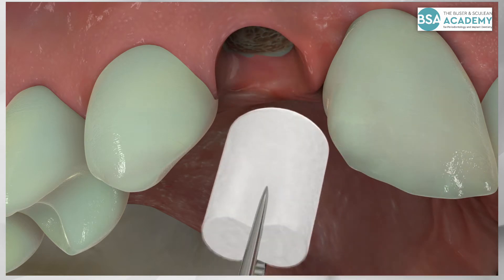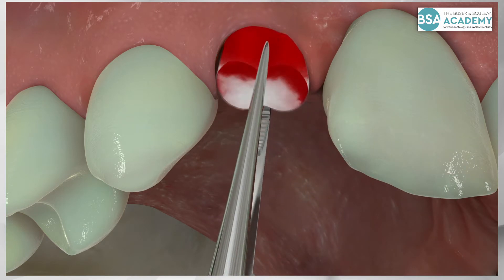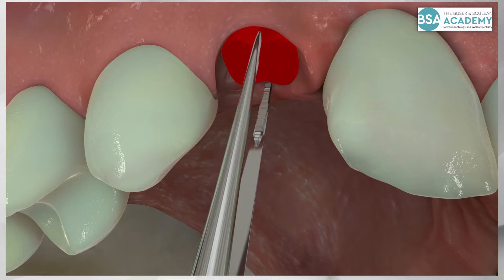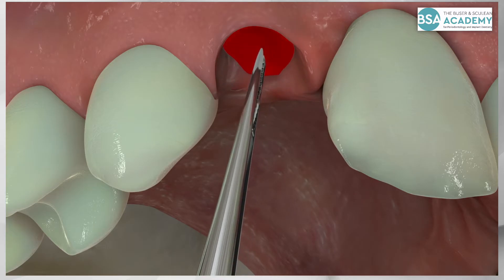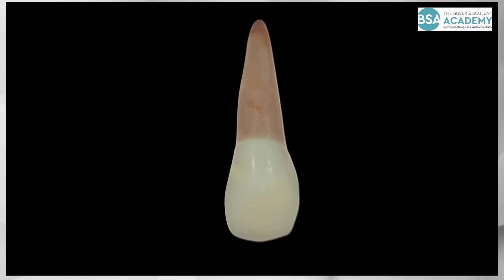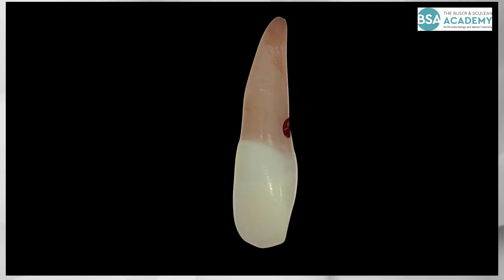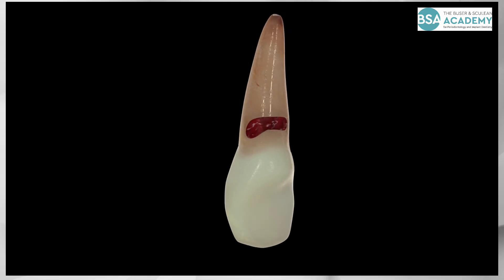A collagen plug is applied for the stabilization of the coagulum, and the socket is left to heal by secondary granulation. The removed tooth shows the area with the external resorption.